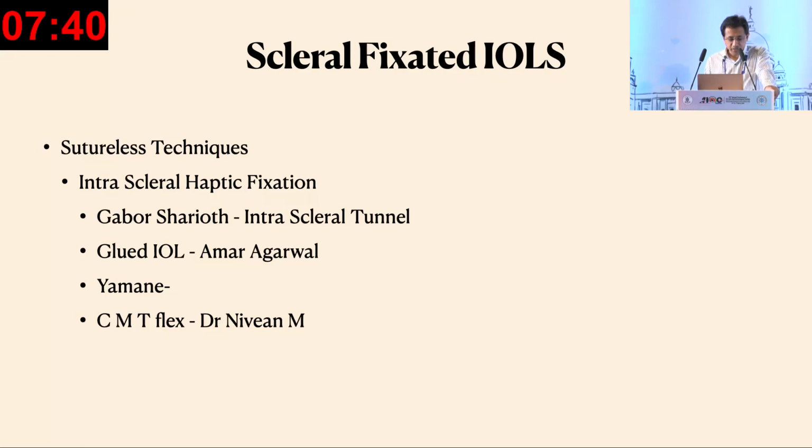The sutureless techniques, which Dr. Nevyas has shown in multiple variations, are the modern way of managing this. The first introduction of the concept was by Dr. Gabor Scharioth, where he created an intrascleral tunnel and the haptics were threaded into this tunnel, and that was what is fixating it. Then Dr. Amar Agarwal modified it, and the glued IOL came into existence.